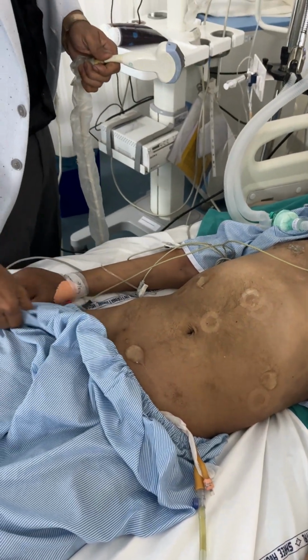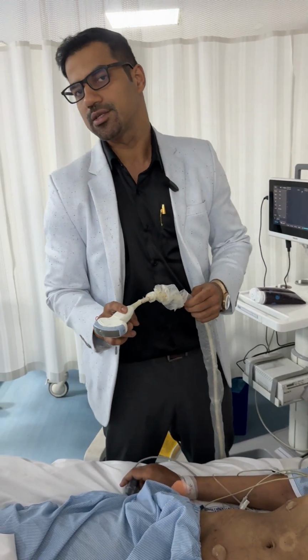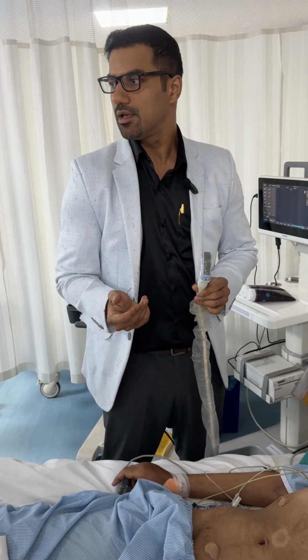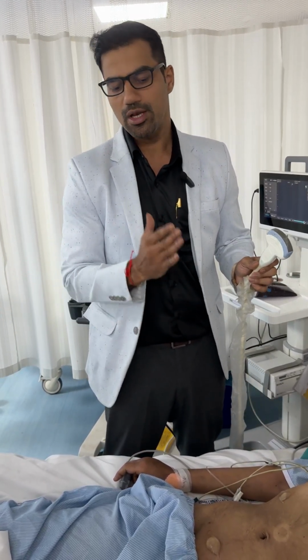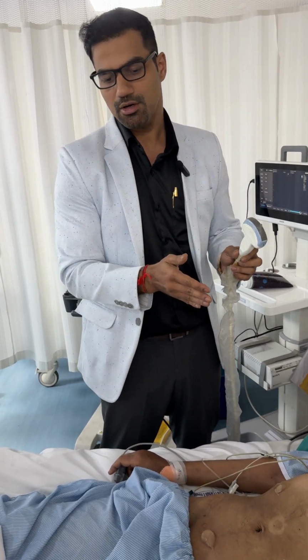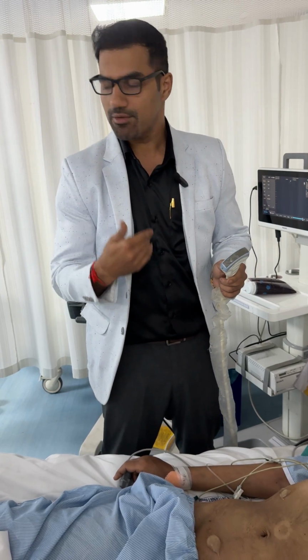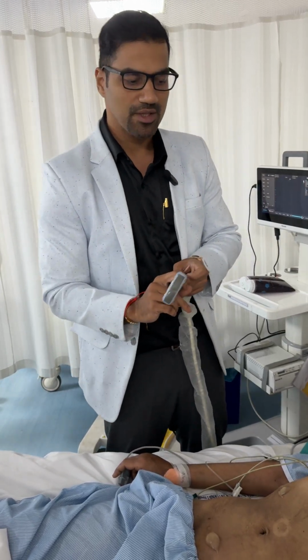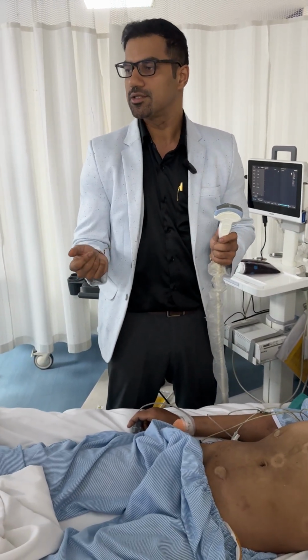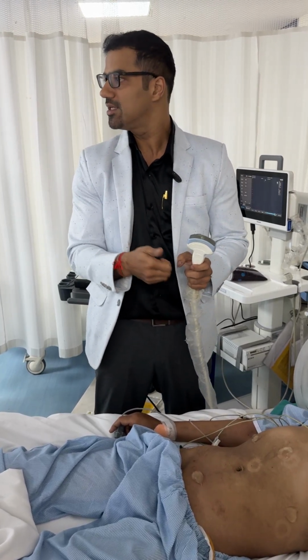So why do we do FAST basically? One more thing. For any traumatic injury, almost 12% are intra-abdominal bleeds, and almost 60% of young adults less than 40 years die because of intra-abdominal bleeds in cases of trauma. So what is more sensitive is diagnostic peritoneal lavage, DPL. But diagnostic peritoneal lavage is invasive. We need to put up a needle and check.